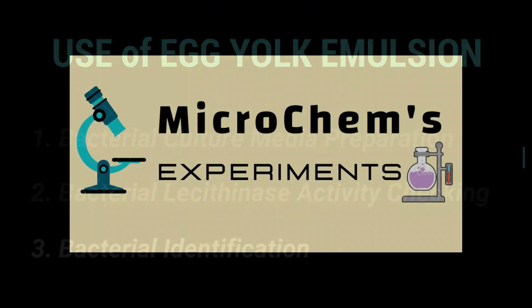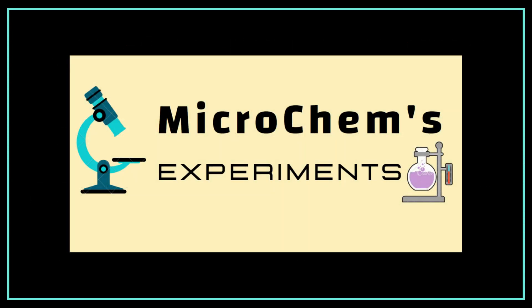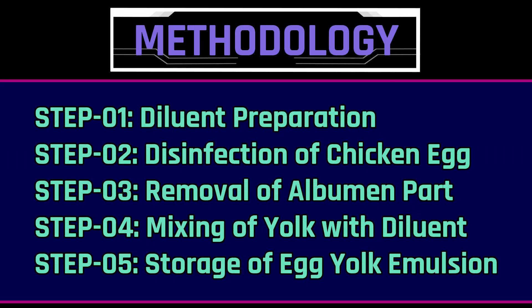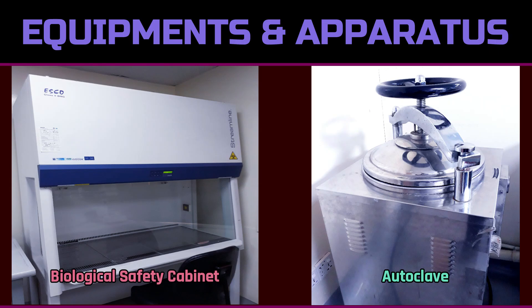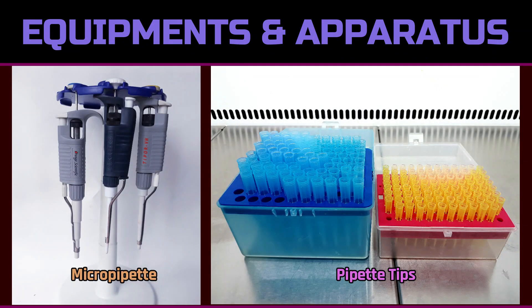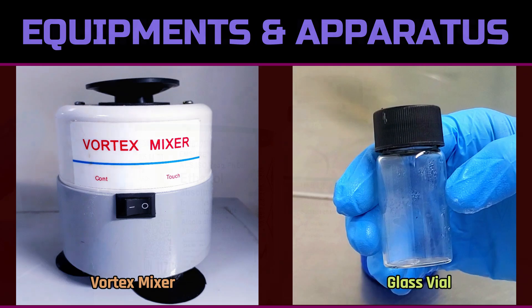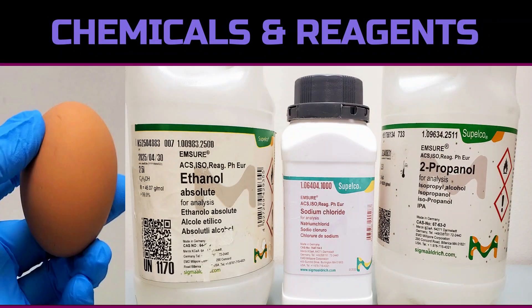In this video, we are going to show you the detailed procedure for the preparation of egg yolk emulsion. Welcome to Microchem's Experiments — be with us, be a laboratory expert. The method involves five steps: diluent preparation, disinfection of chicken egg outer surface, removal of albumin part, mixing of yolk with diluent, and storage of egg yolk emulsion. Throughout the procedure we need a biological safety cabinet, autoclave, micropipette, tips, vortex mixer, glass vial, chicken egg, absolute ethanol, sodium chloride, and isopropanol.